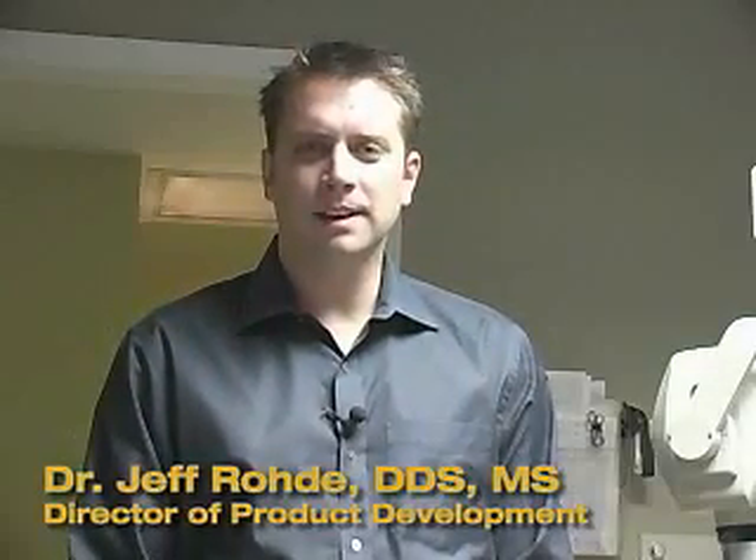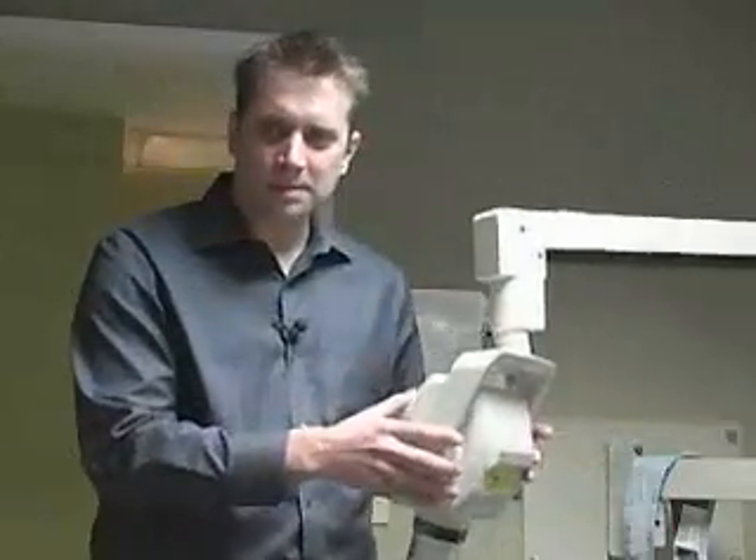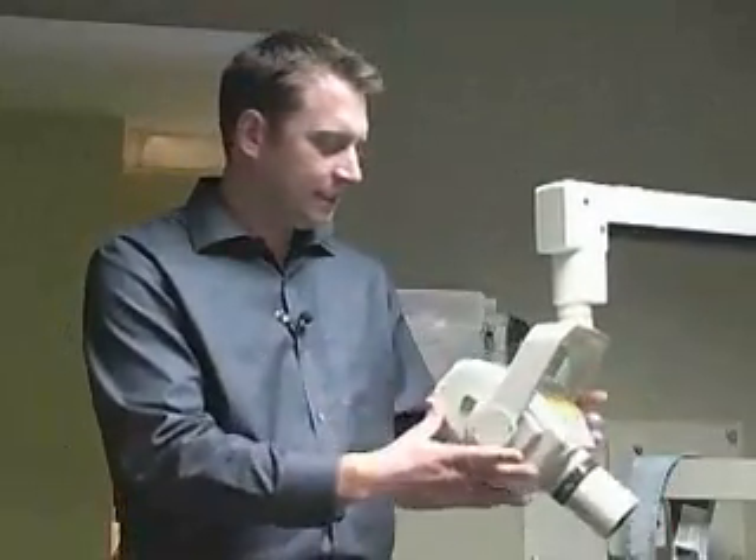Hi, I'm Dr. Jeff Rohde with Dental Compare, and in today's Up Close Feature we have some exciting new technology to show you. Traditionally in our offices we have x-ray generators on swing arms attached to the wall. They're somewhat cumbersome to move around and they're always drifting when we're trying to get that perfect shot.